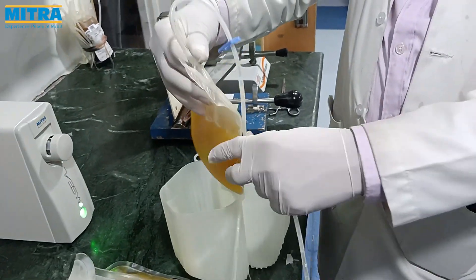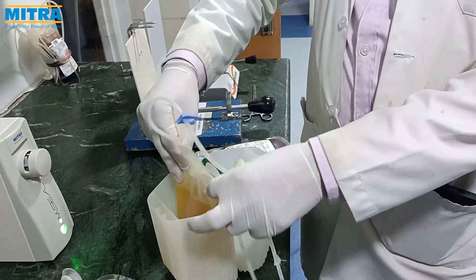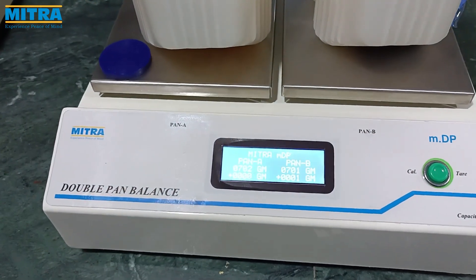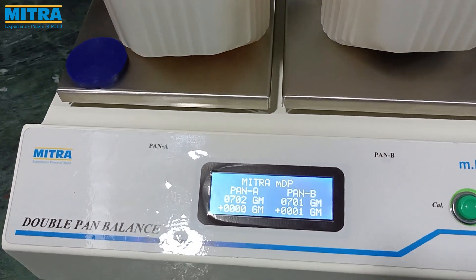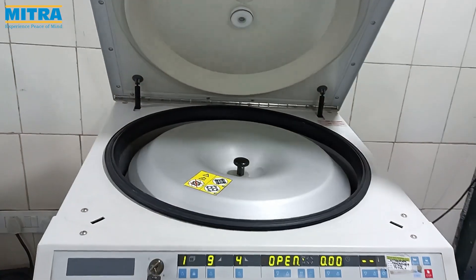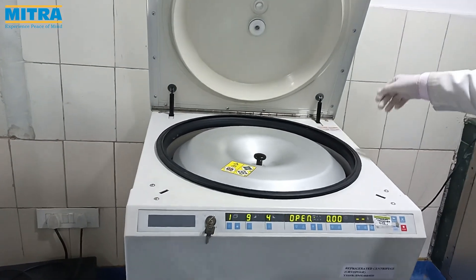Now we centrifuge again the platelet-rich plasma containing platelet bag and the plasma bag. We pack them both in the centrifuge bucket as shown and balance them, then centrifuge in the refrigerator at the chosen speed.